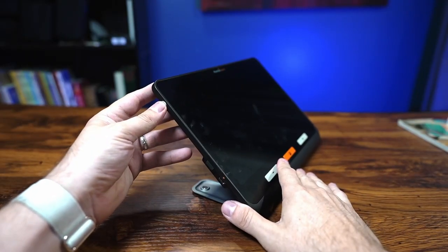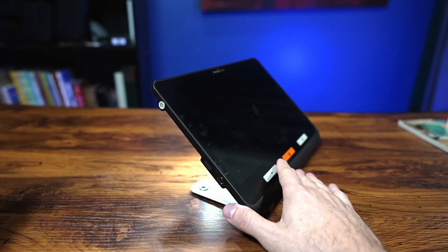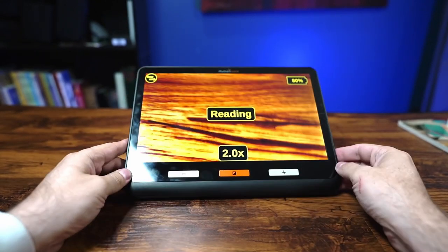On the top, there's one camera button. On the left side, there's your power button — tapping it will also put the device to sleep. You also have a charging port and a port to connect it to an external monitor or computer.